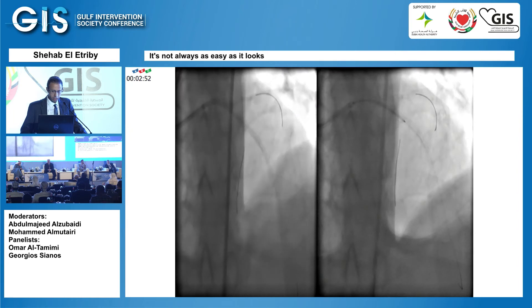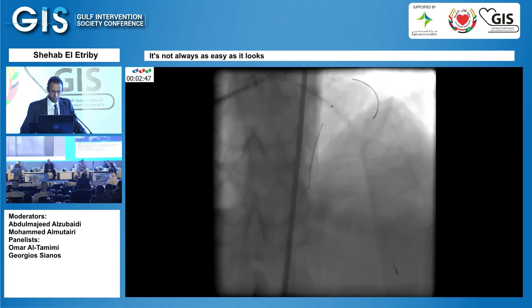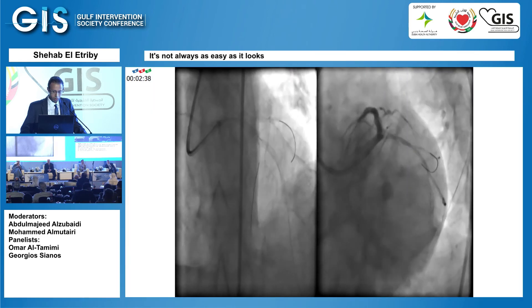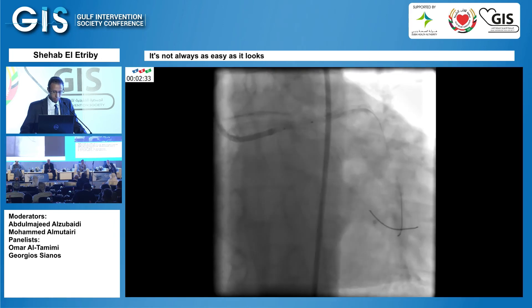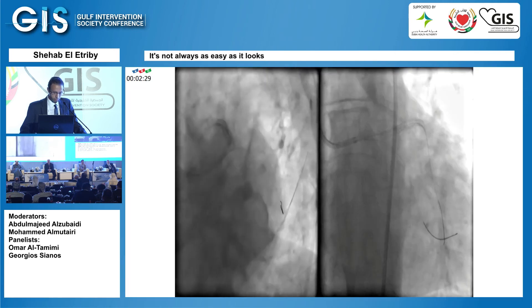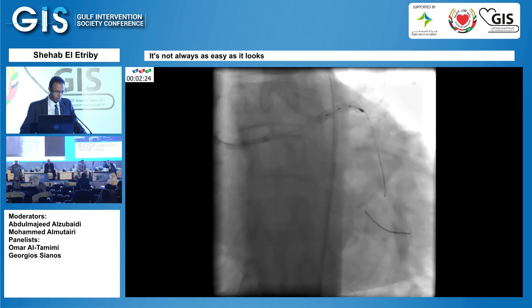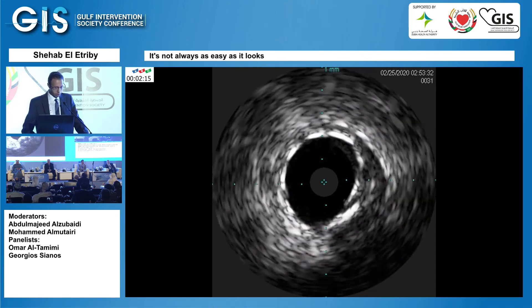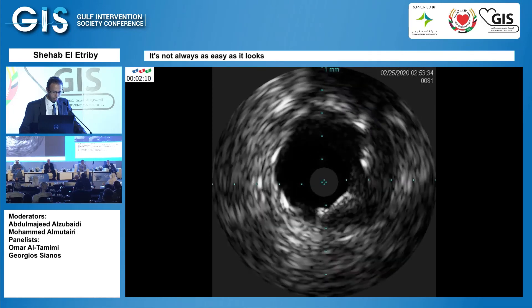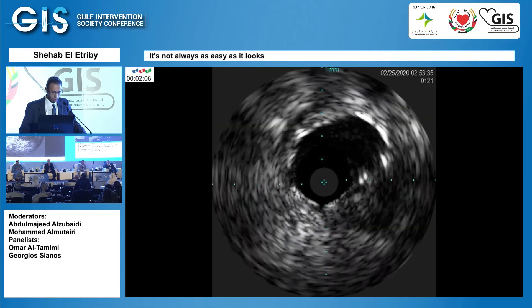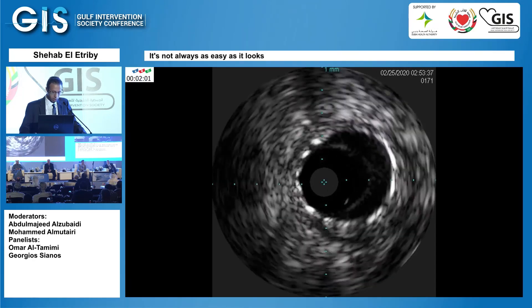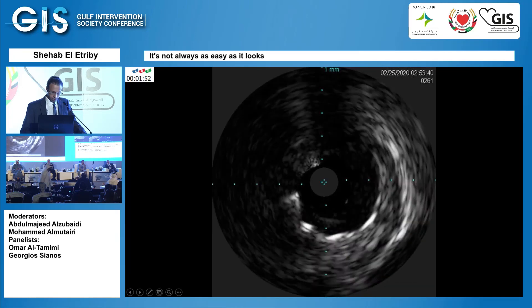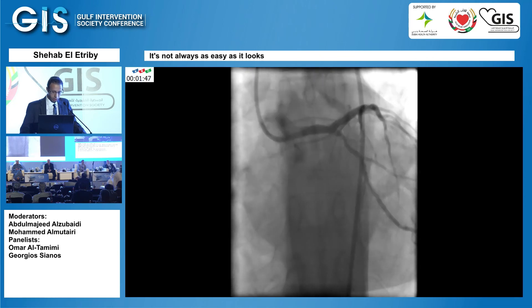The second stent was a 3.5 by 38. That's the view after both stents. A 4 NC balloon was inflated at high pressure, then I decided to take a larger balloon — 4.5 — in the left main and inflated it at high pressure. This was the final IVUS after optimization of the left main stent — as you can see, everything is okay, with a well-apposed stent up to the left main ostium. This was the final angiographic view in the PA cranial and spider views.